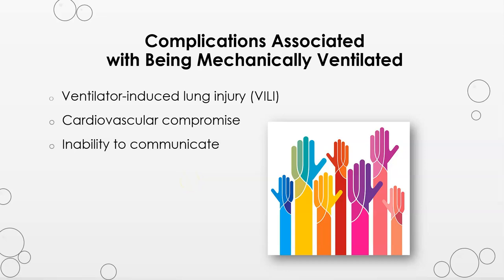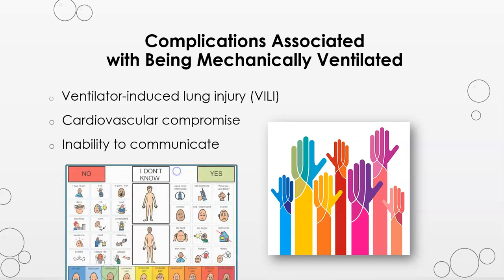You may not think that communication or lack thereof is a complication, but the patient who cannot speak cannot communicate their needs, and that could be an issue. Here's an example of a tool that can be used to help with communication.